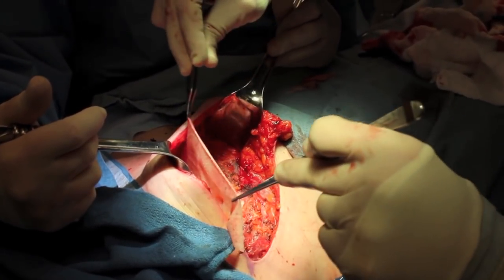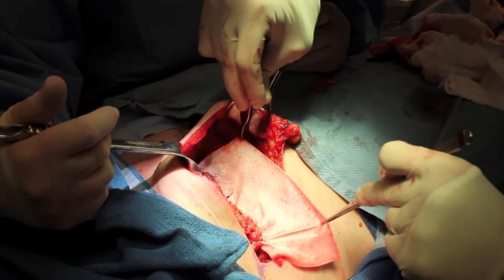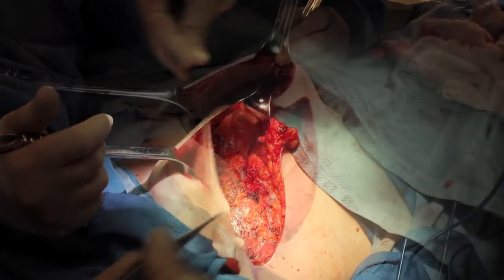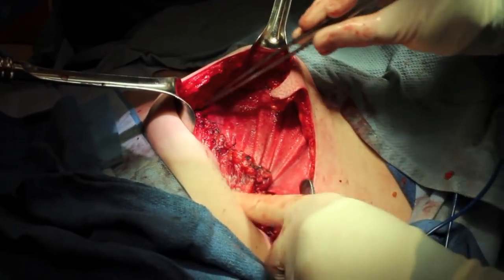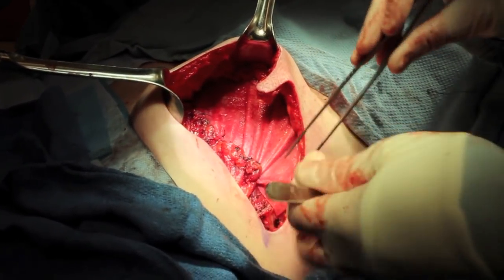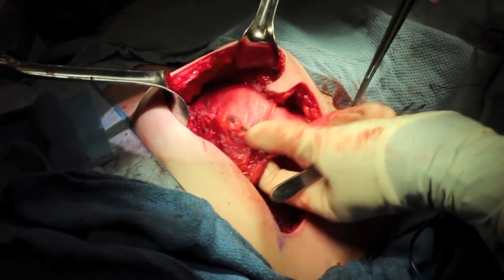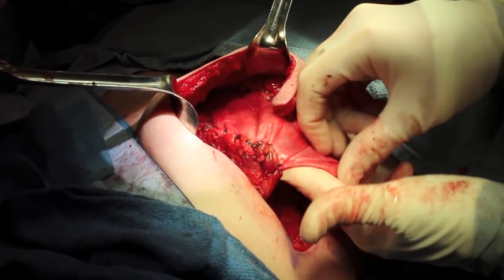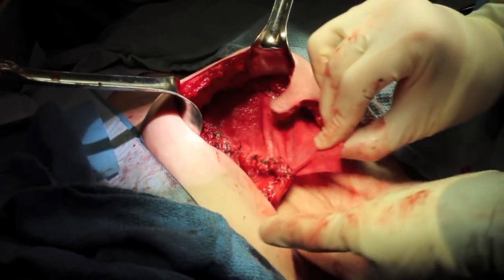Here is the allograft sutured to the pectoralis major muscle, and you can start to see the pocket that's being developed. Here, it's been sutured to the inframammary fold, and the lateral part has been left free, but you can start to see the beautiful pocket which has been created in order to hold a tissue expander.